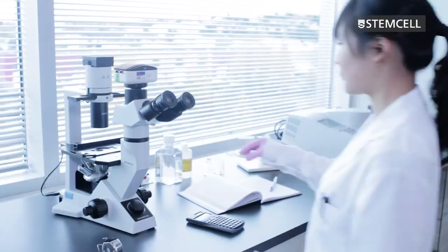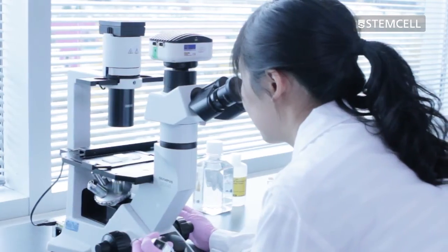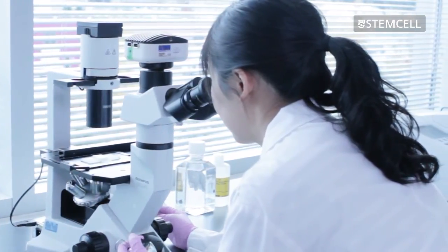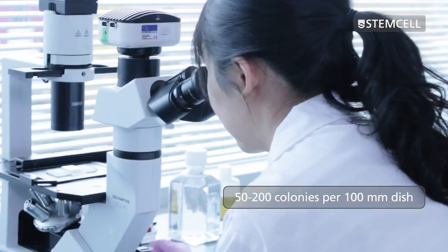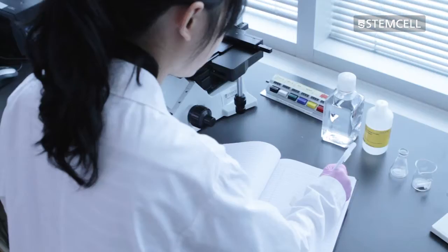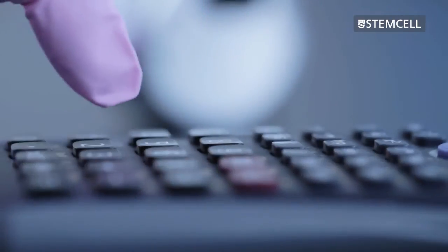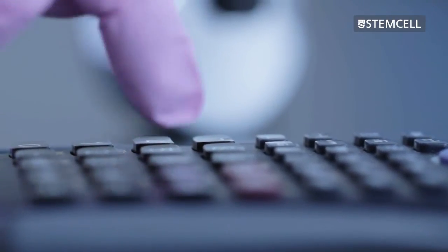To prepare the cells for semi-solid cloning, remove the cells from the incubator. Cells can either be harvested by centrifugation or transferred directly from the culture flask; regardless of which method is used, they must be in a single cell suspension. Perform a viable cell count and calculate the number of cells to plate. Plating at various cell densities is recommended to achieve 50 to 200 colonies per 100 millimeter dish. The plating cell concentration will need to be determined experimentally, as it will vary depending on the cell type, transfection efficiency, and the condition of the cells.